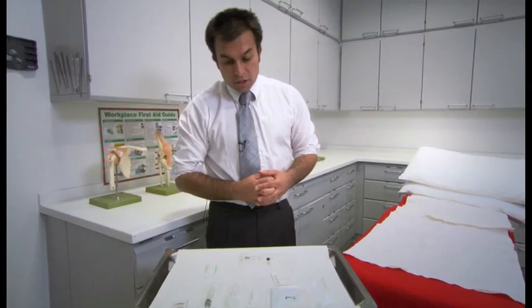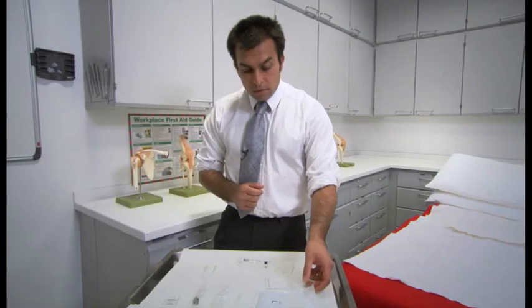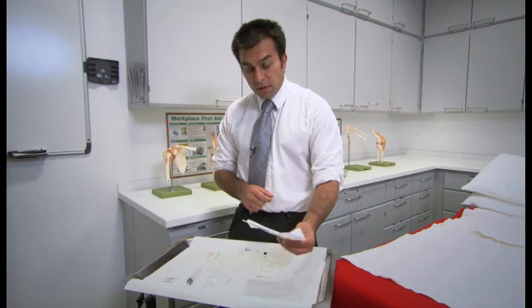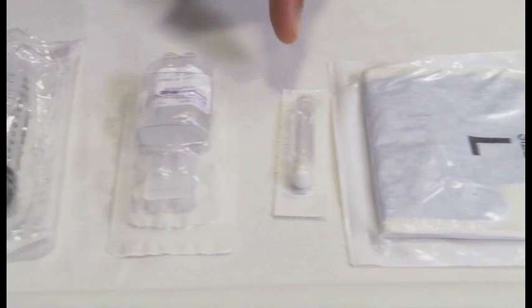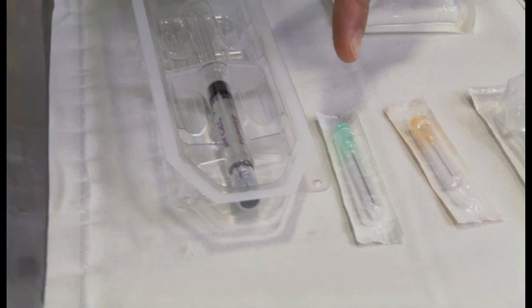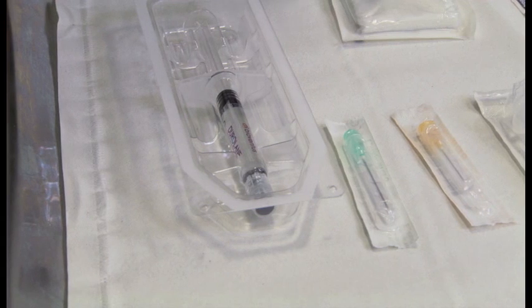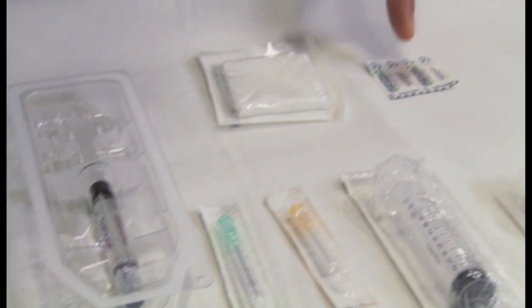To administer an injection of Durolane, one must prepare an injection tray. To comprise the injection tray, this must include some sterile gloves, some skin prep, in this case chloroprep, some local anaesthetic to be administered via a separate syringe using a 25 gauge orange needle to raise a bleb of anaesthetic, followed by the depot injection of Durolane to be administered with a 21 gauge green needle, and finally some dressing gauze and a wound dressing.